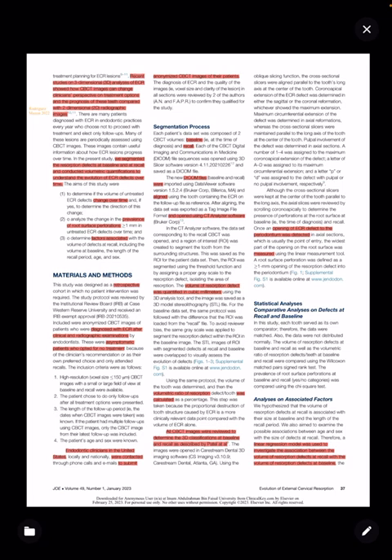Following that, each patient set of DICOM data was aligned on a data viewer before being exported to CT Analyzer software to quantify resorption defects in cubic millimeters and ratio of resorption. Also, the 3D classification of Patel was assigned to teeth at baseline and recall CBCTs.